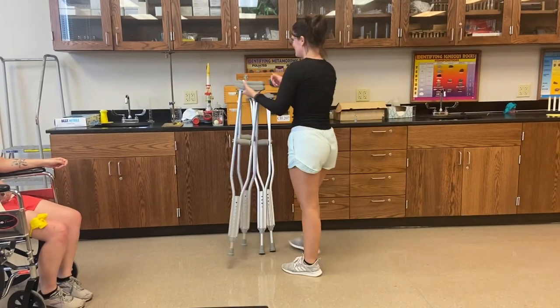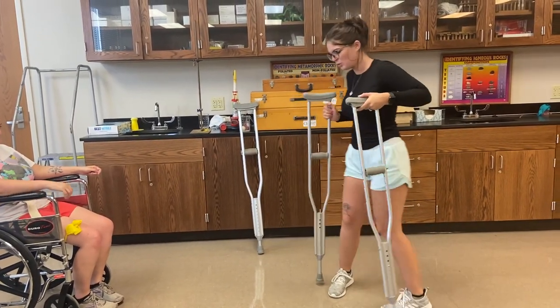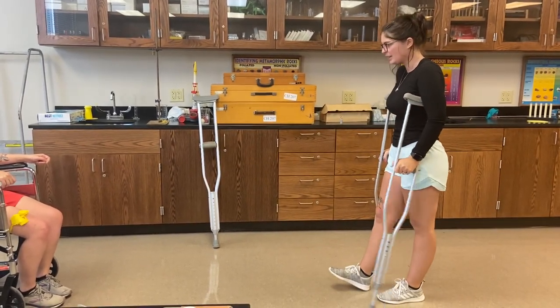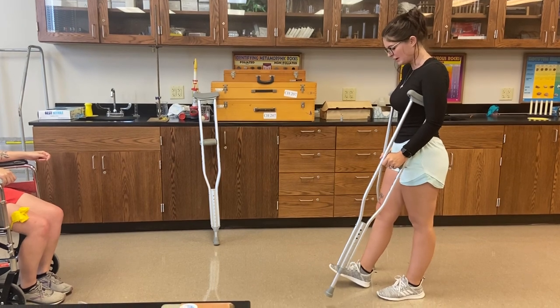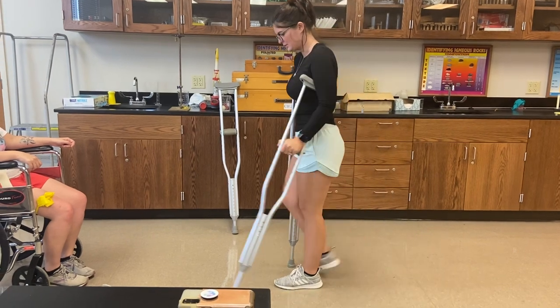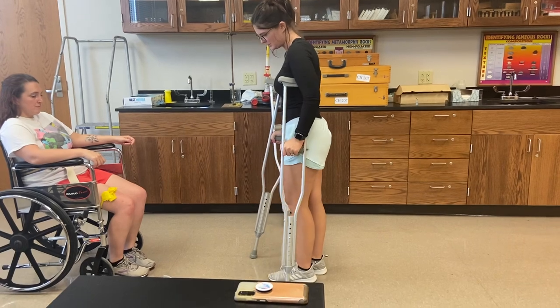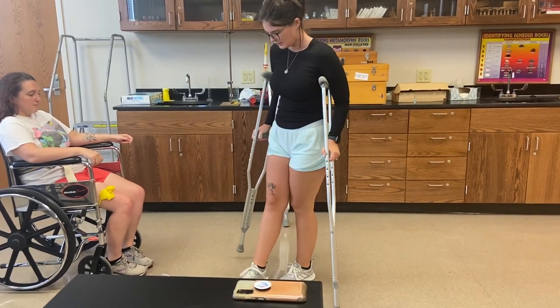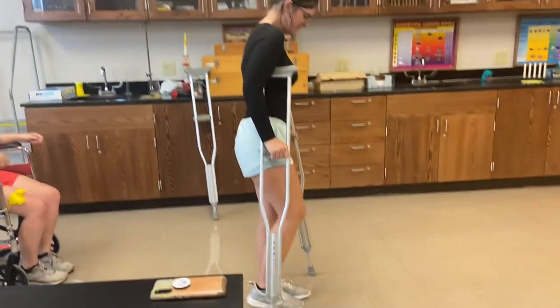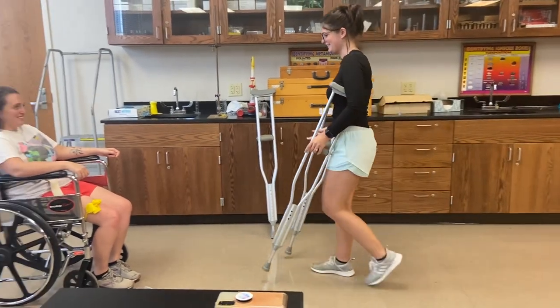So the next one we're going to try is a two-point gait pattern. You're going to do your bad leg with the left side crutch at the same time, and then good leg with the right crutch — good leg, crutch, bad leg, crutch. Then you'll turn towards your good side. Sound good? Sounds good.